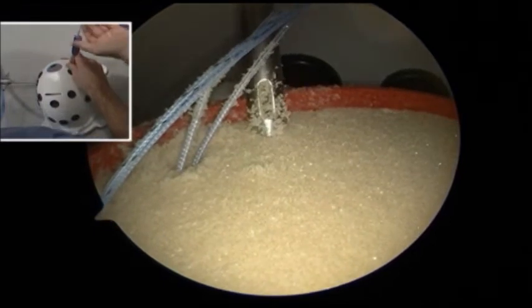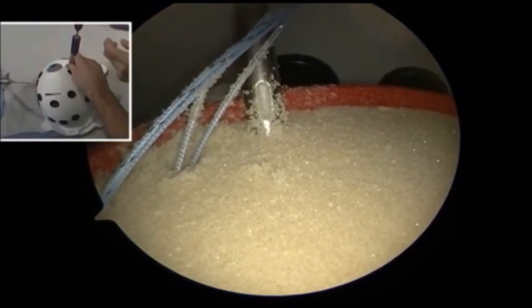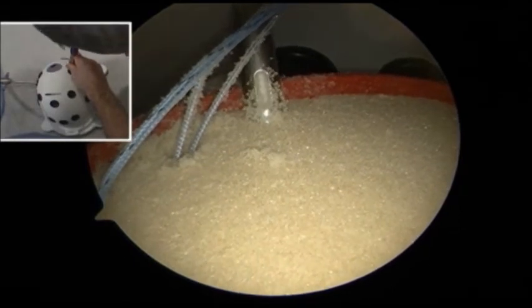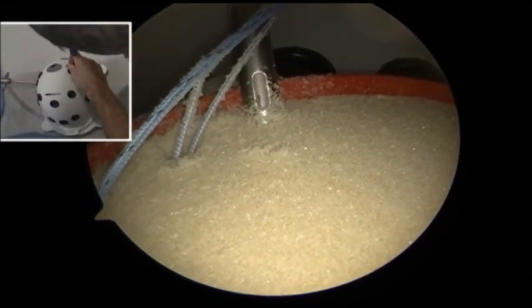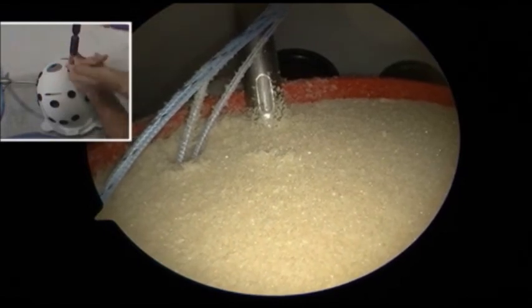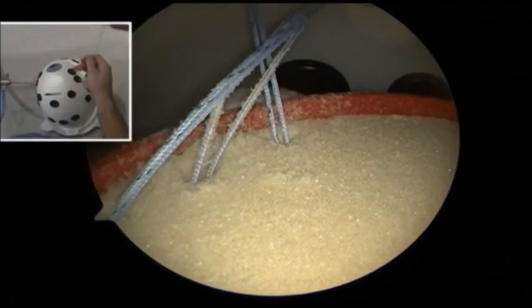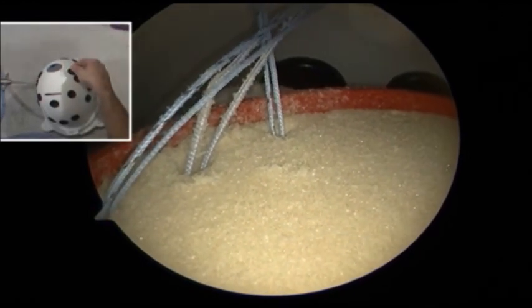And then you have to fiddle a little bit to find the spot again to put the anchor back down onto. So it's best if the drill stays on forward until the person gets all the way out to decrease that friction. Pull on this one, it stays in.